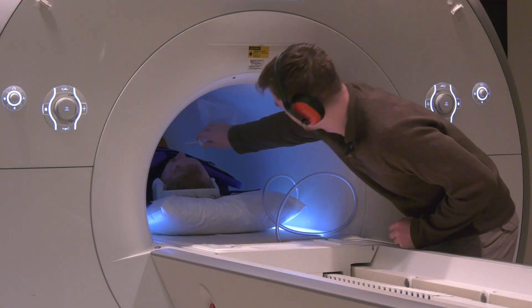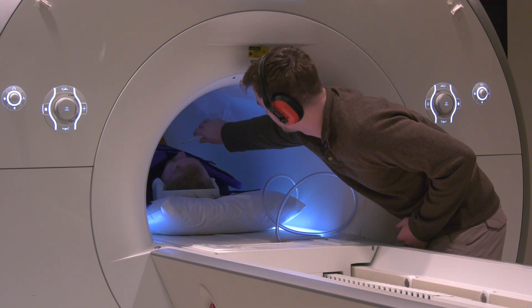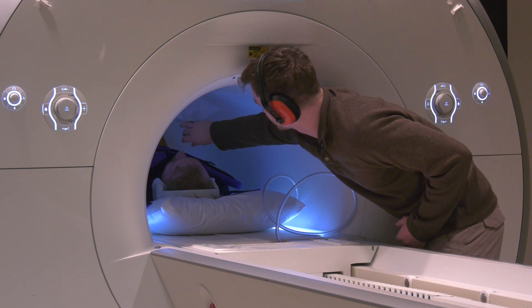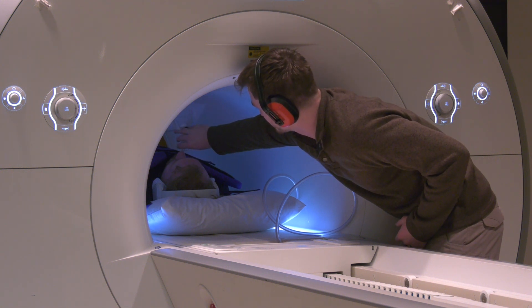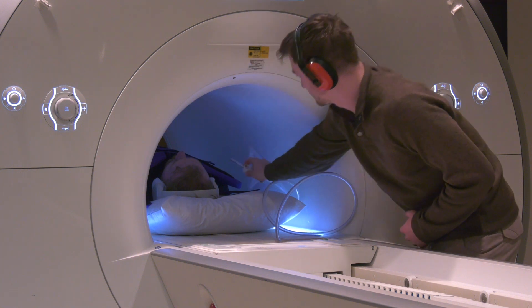All right, here comes the bag. Go ahead and take a breath in and breathe it out. Take another breath in and breathe it out. Here comes a straw to breathe from — breathe in, breathe in, breathe in. Hold your breath. Scan. And breathe.